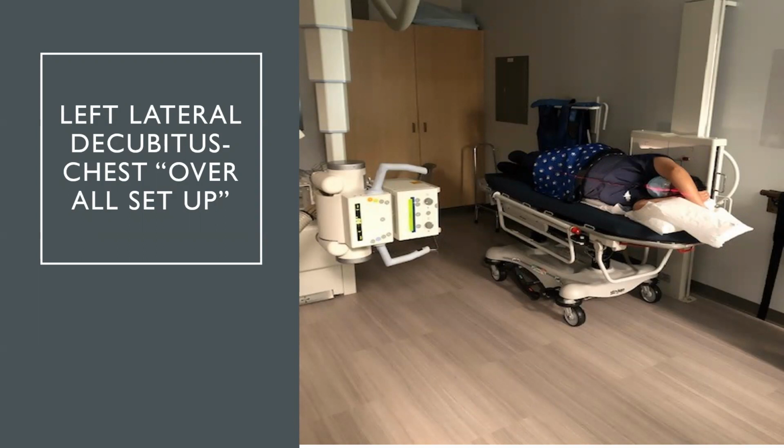The IR size is 14 by 17. The IR orientation is landscape. The IR location will be wall bucky or tabletop. However, the wall bucky is easier if the patient is on the stretcher. SID is 72 inches.